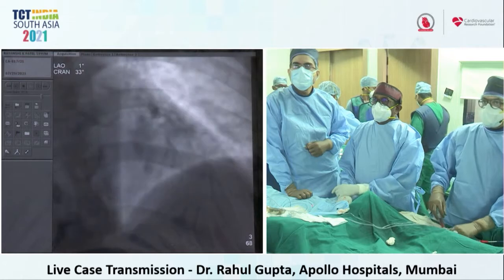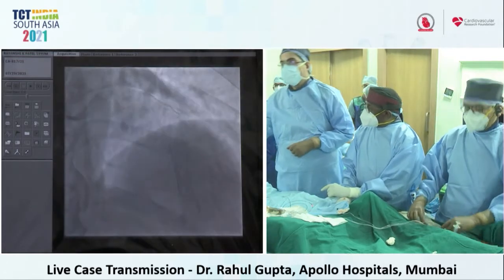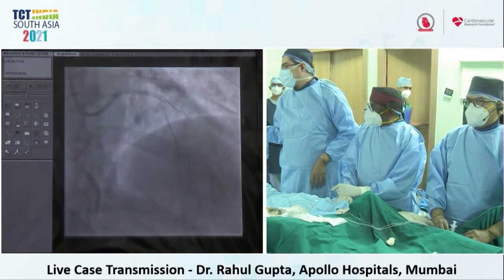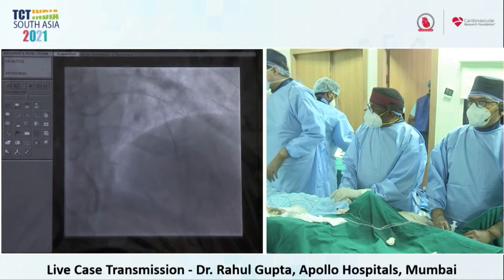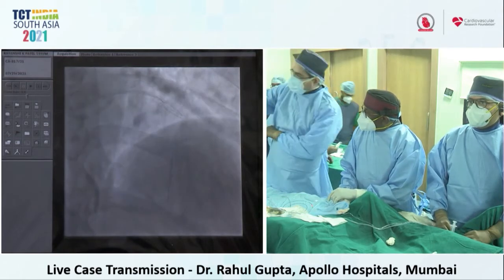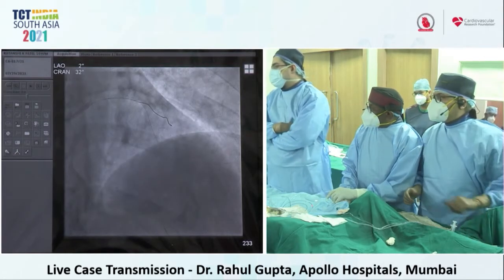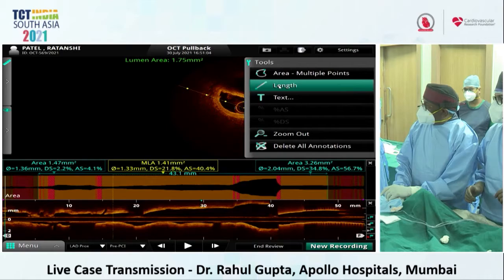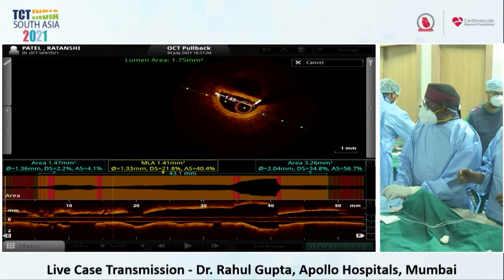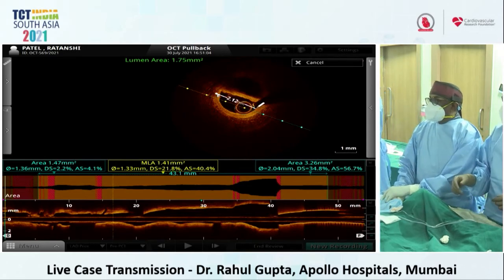Okay. Yeah. Look, take the measurement. Distal diameter. Go to the distal side and then come. Just check, Charan, take the diameters. Meanwhile, go down. Just show the OCT picture again. Can you show the OCT picture on the shift to the OCT? Just run it and go to the proximal area.